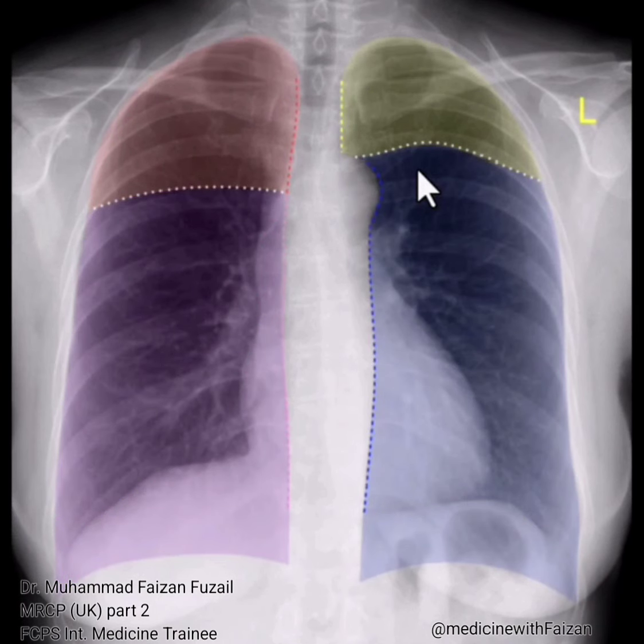So if we look posteriorly now, I've emphasized the fact that the posterior costophrenic recesses go down below the level of the hemidiaphragm on your frontal projection. So this is all lower lobe. The aortic knuckle and descending aorta are outlined by the left lower lobe, and all of this lung, importantly behind the heart in the retrocardiac area, is a portion of the left lower lobe.